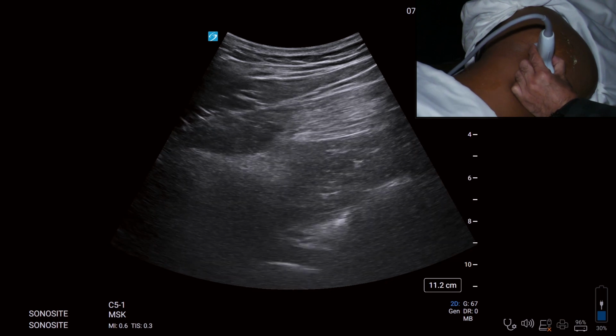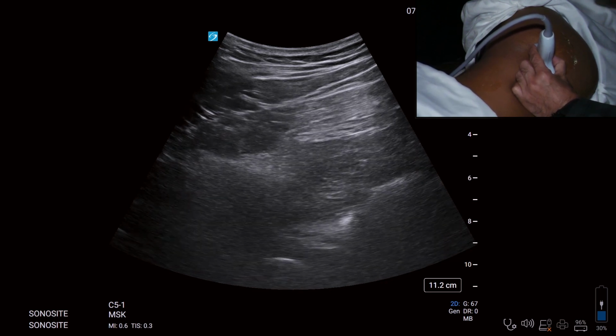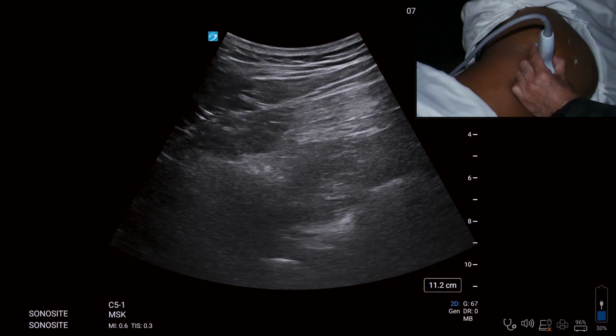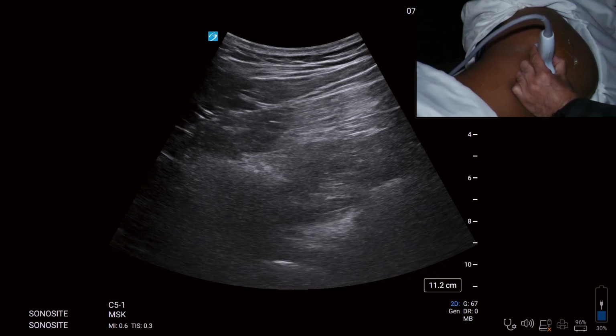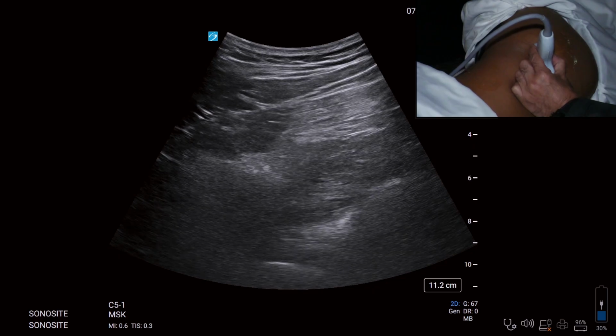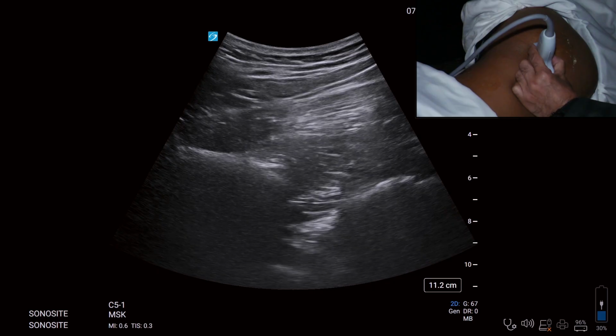Is this concept clear? And we'll start with 1.5 milliamperes, drop till 0.4 to 0.3 milliamperes. Again, 15 to 20 mLs of the drug is required to produce anesthesia. For anesthesia, we'll use 0.5% ropivacaine. For analgesia, we're going to use 0.2% ropivacaine.